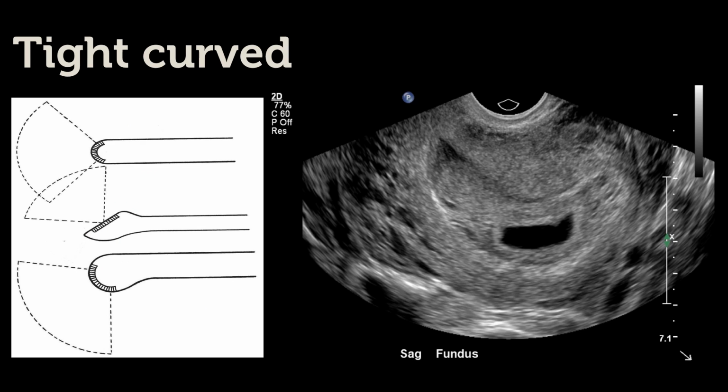Tightly curved arrays are very similar to the curvilinear probe, except that the curve is much tighter, as seen in this schematic. The frequency range of these probes is at a mid-level, so they scan between 9 and 5 MHz or between 8 and 4 MHz and are used for intracavity scans such as transvaginal scanning for gynecological purposes or for the assessment of first trimester pregnancies.